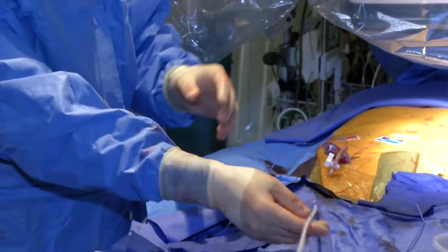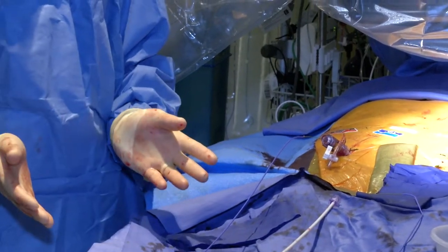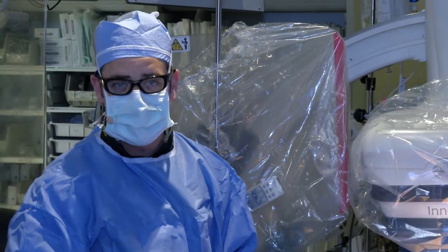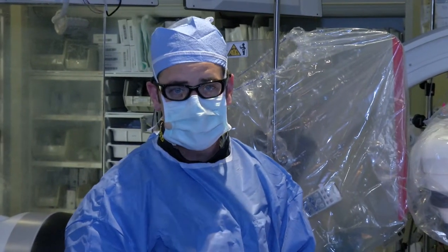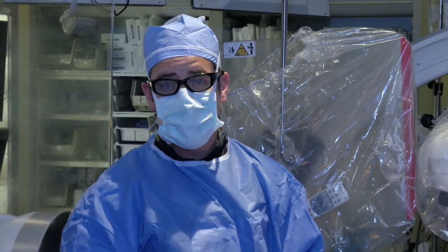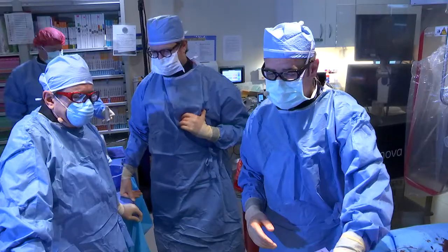And we also put the dilator in for another reason, because the e-sheath, unfortunately, occasionally the seam will actually be split wide open. And if you just pull the sheath back, it'll spray blood all over everybody, and then we get very upset. The dilator helps to reduce some of that spray when that happens. And that's more of an issue with tortuous vessels, and more of an issue with the 29, because there's more stretching of the sheath. So again, those issues, or at least that issue, will be gone when we get ultra and we're not dealing with the e-sheath anymore. So, okay? Thank you.